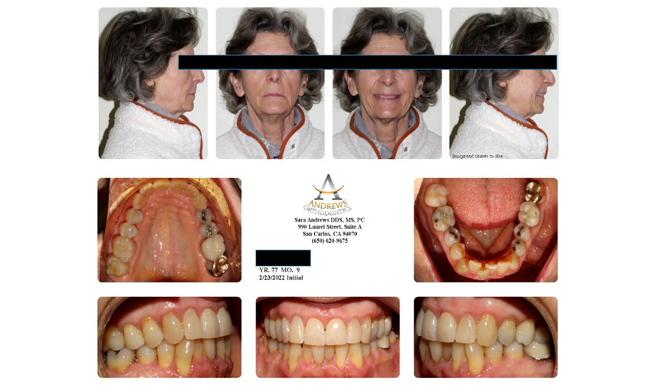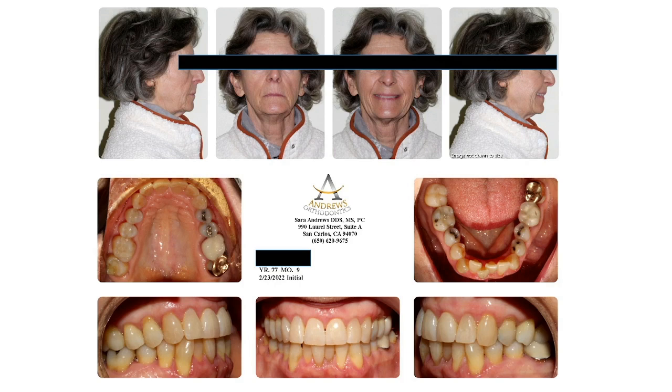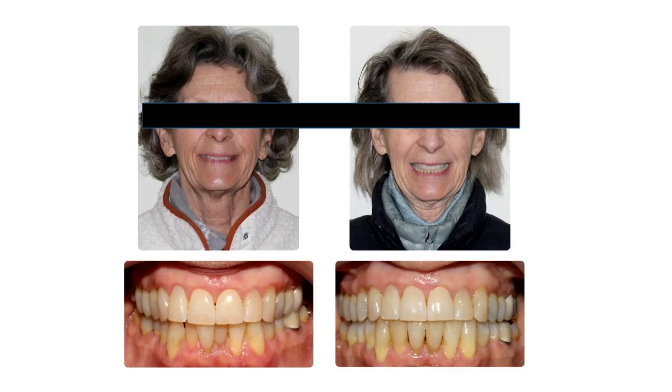So this one, she looks really good. Like I told her, I said, okay, you know what? Your gum recession, that tooth number 24, the gum is higher. This is what I tell them. I said, at the end, we may worsen your recession, but what's going to happen is your gum line is just going to be more even. The one that's high is going to be low, and they're all just going to be more even. And that's what we did, and she's super, super happy. She's showing her lower teeth when smiling, because that's what they do when you take the final photo. They want to show their straight teeth.